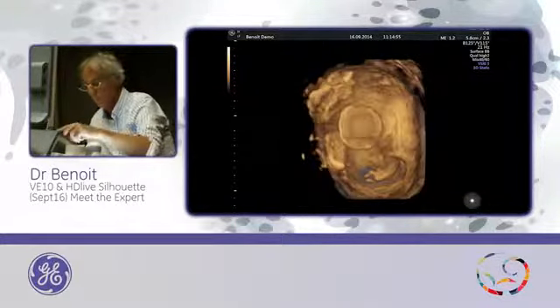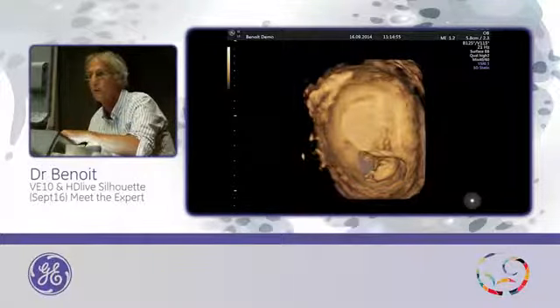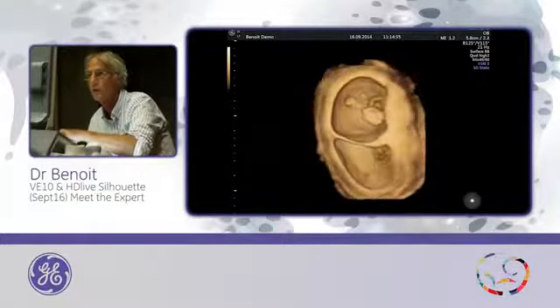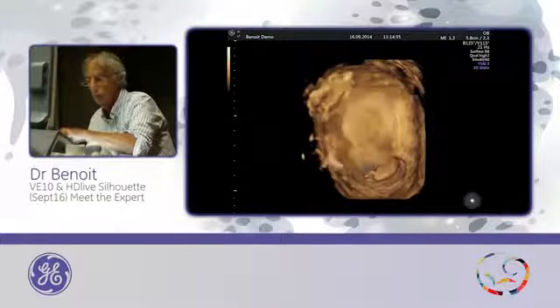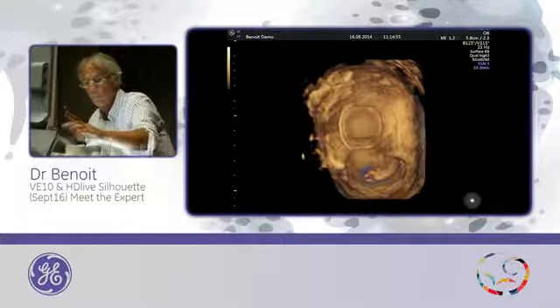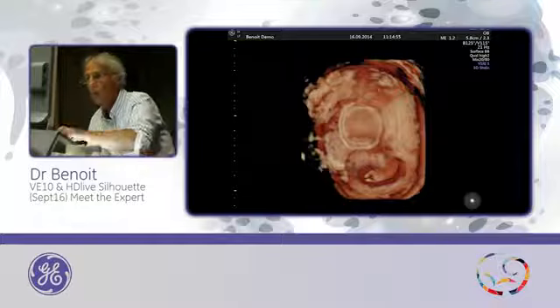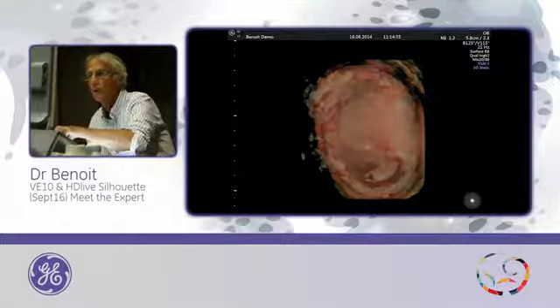First, I start with a classic 3D rendering, one embryo, the other gestational sac, and the second embryo. I switch to HDlive. This one. Increase the silhouette.